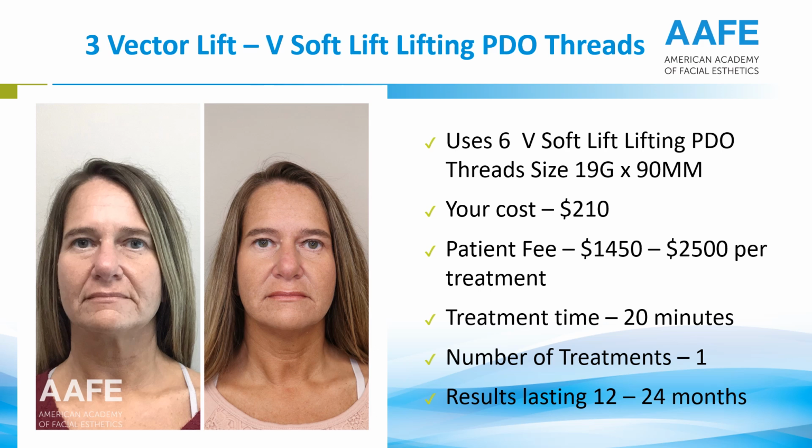Now, let's talk about patient fees and how we do this. Again, this only applies to VSoft lift, because if we're doing a 3-vector lift on each side, look at this before and after. That is amazing. So 3-vector lift, only VSoft. If it was any other company, it would be a lot more. So you're going to have to charge a lot more.